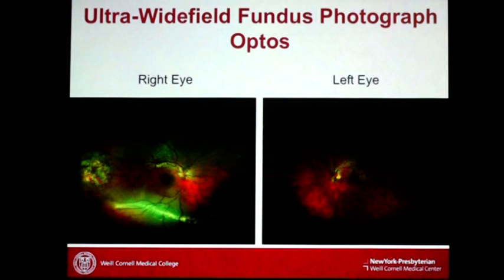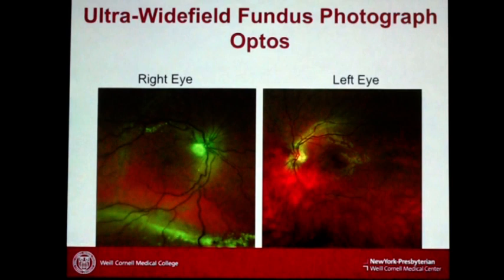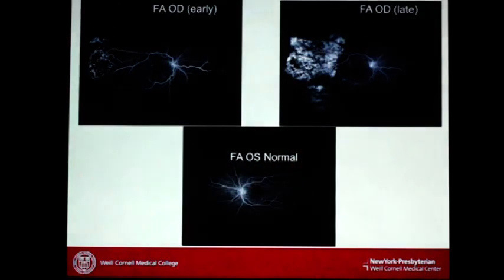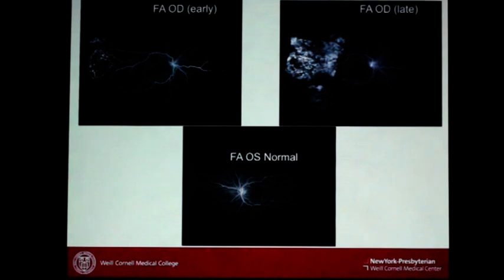So in this case, we took a good look. Here's a larger mag, large detachment, exudation. But when we get our fluorescein, we can see how vividly these telangiectasias stand out, right? So we know where our pathology is. Mostly here. Okay, so with the fluorescein angiogram function on this unit, beautiful.